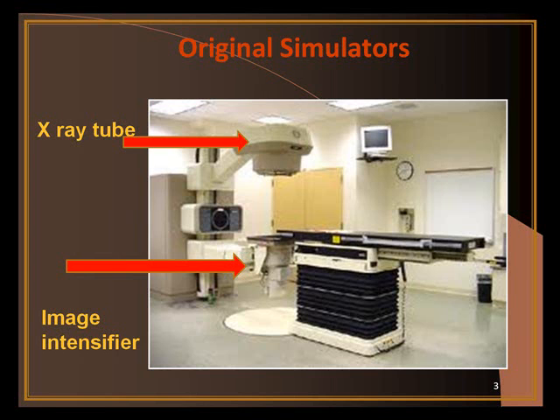They've been replaced with amorphous silicon plates. So over the years, they've been replaced by amorphous silicon plates, and the amorphous silicon plates are digital imaging plates. They're a lot smaller and flatter, and they just create these X-rays into a digital picture. Okay. So there's some background on that.